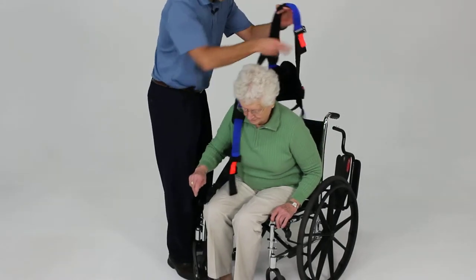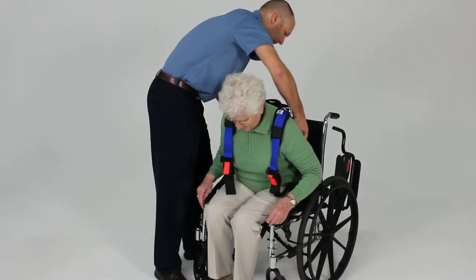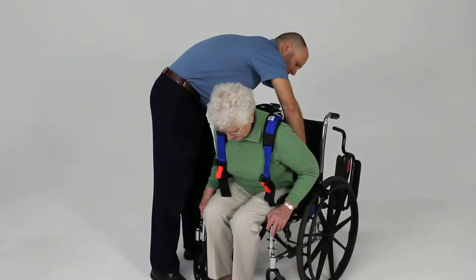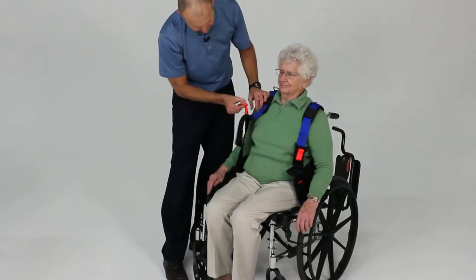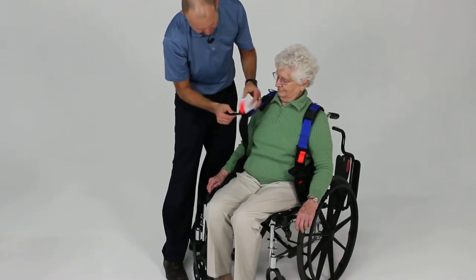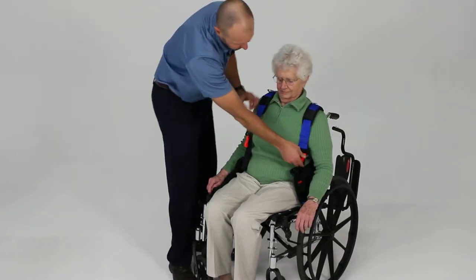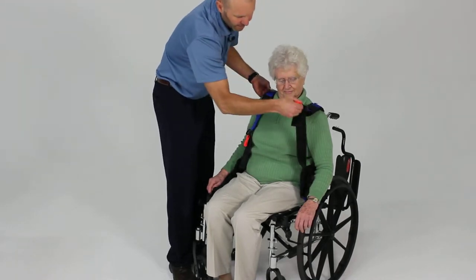Have the patient lean forward as far as they can, and then go ahead and tuck that as far down on their bottom as you can in this position. Go ahead and lean back. If you need to, you can loosen the shoulder straps by lifting up on the orange webbing and tighten by pulling down on the black webbing to push it farther back down. Sometimes you need to lengthen those up a little bit.